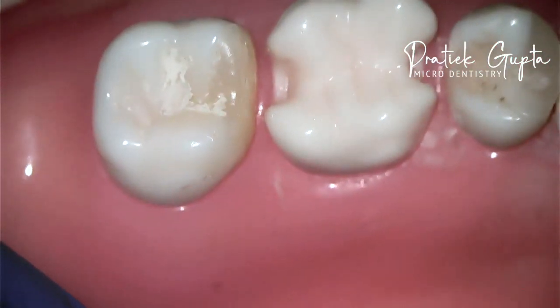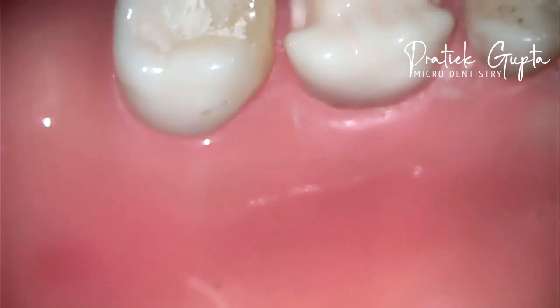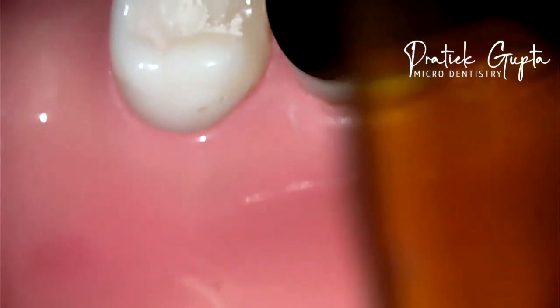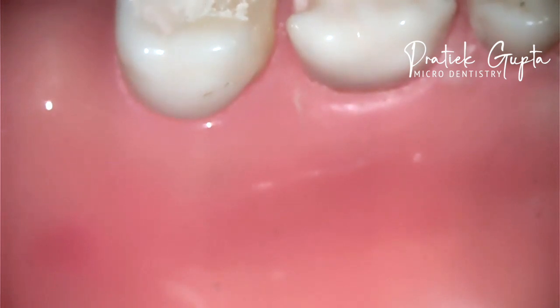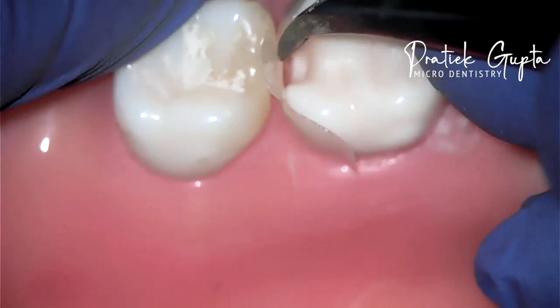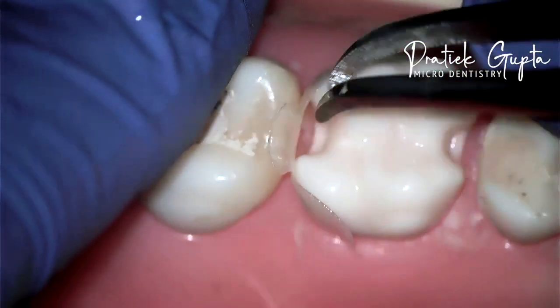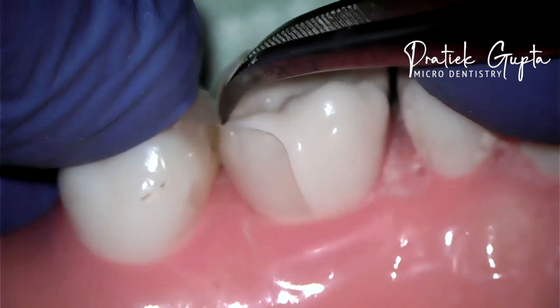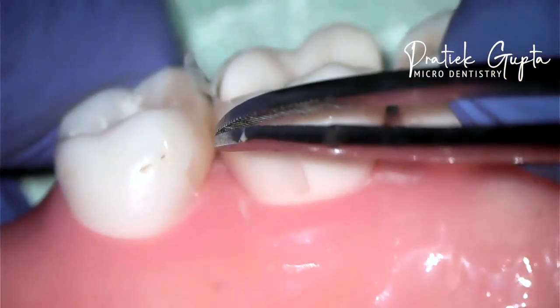So hopefully we've answered both questions: one is how to select the matrix, and two is how to restore the opportunistic access. Once you've restored the proximal opportunistic access, you can then go ahead and restore your adjacent Class II. Measure the depth of the cavity, choose your matrix accordingly, and make sure the matrix is sitting flush against the adjacent tooth's marginal ridge — that makes it easier afterwards so you don't have a lot of cleaning, your contact is at the right place, and you have a nice embrasure everywhere.